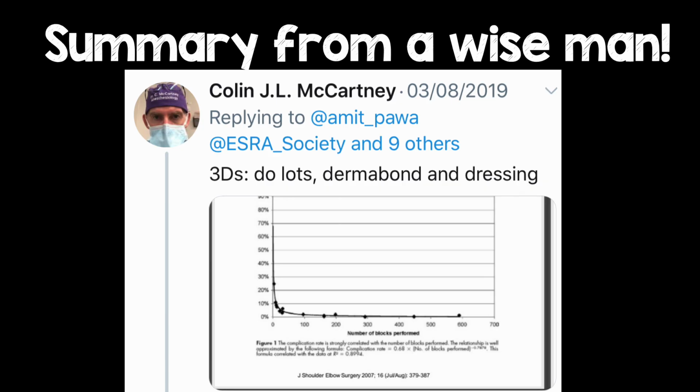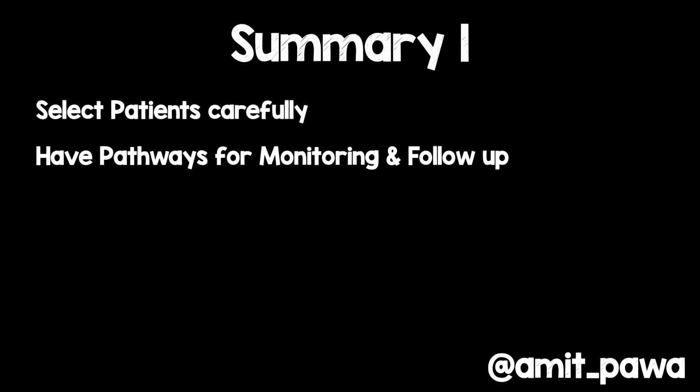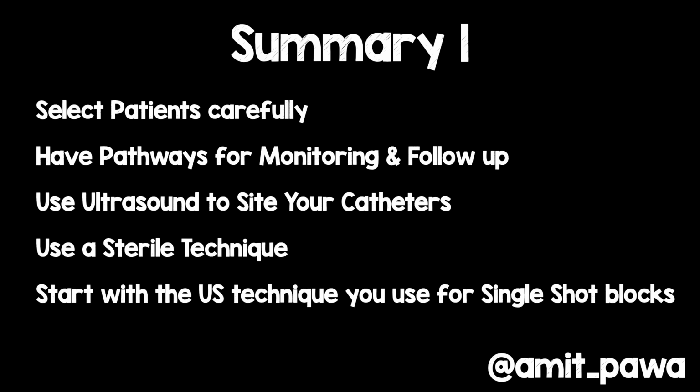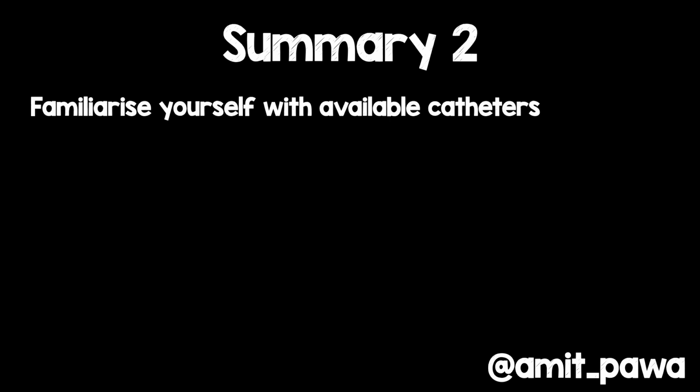So what are my summary of the tips? Well, Colin McCartney says it very well. Three D's: do lots of catheters, use Dermabond, and use sensible dressings. So how am I going to summarise? Well, we need to select our patients carefully and have pathways for monitoring and for follow-up. Use ultrasound to site your catheter so you make sure you're siting the catheter tip in the correct place. Use a sterile technique. Start with the ultrasound technique that you use for single-shot blocks, and most of the time that's going to be short axis in-plane or out-of-plane, depending on what your preference is.